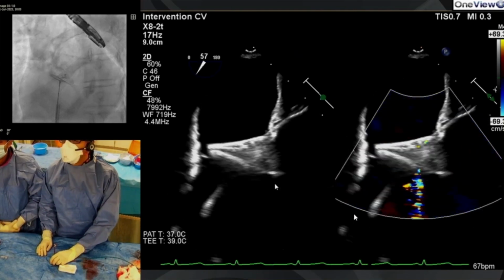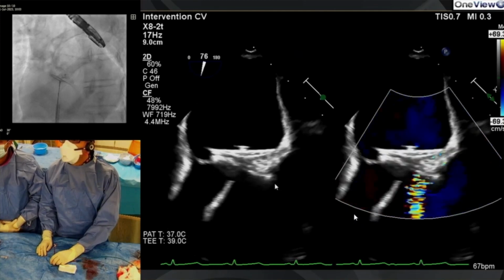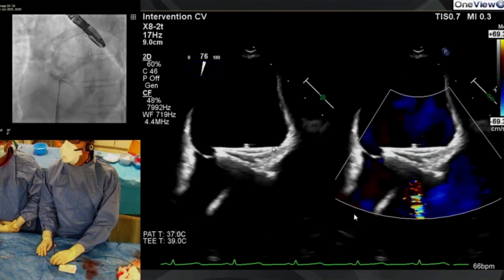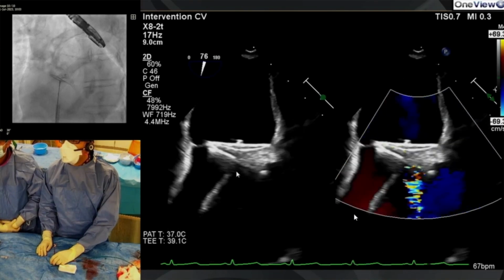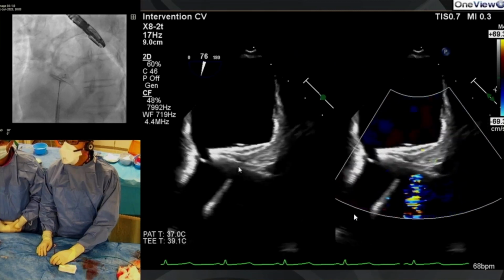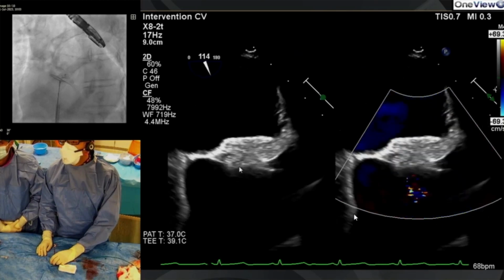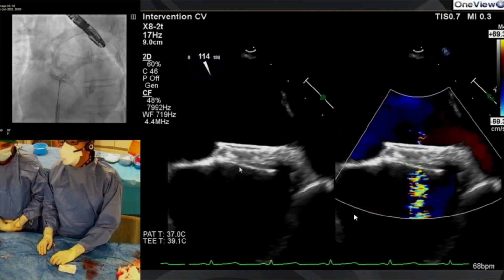So I'm going to go around and quickly look at the other views. Again, I'm trying to show the central pin of the device while I'm imaging, so I know I'm transecting through the middle of the device, and then I can get a good idea of what's going on here. Septum secundum, you can see it's slightly opening, but I think part of this is because it's angled on the cable, and hopefully that will get better as we release. So I'm looking for color, and again, the central portion, then swinging through to look at the septum secundum and primum. So actually, this device is looking very nice.